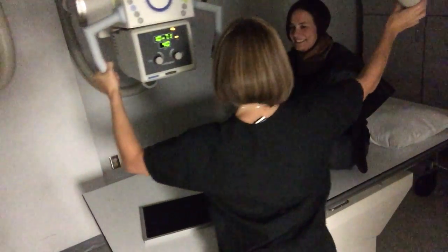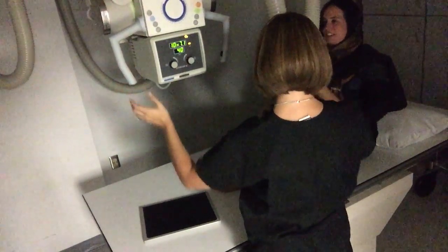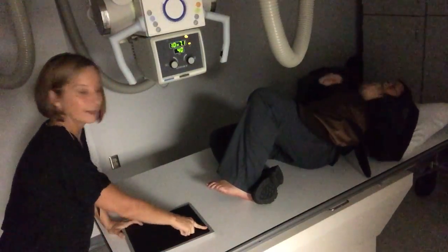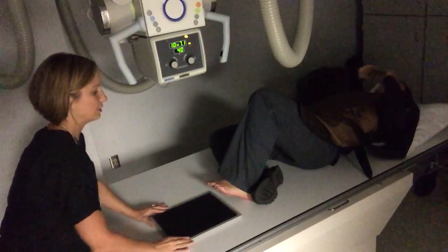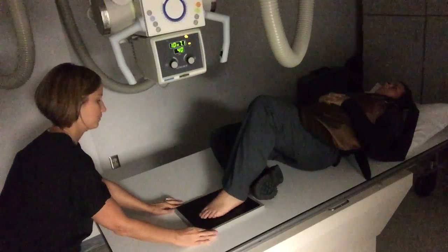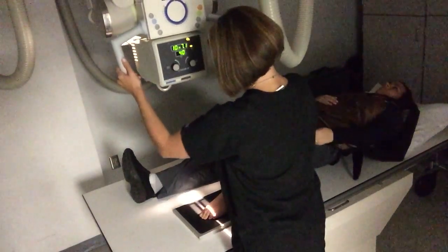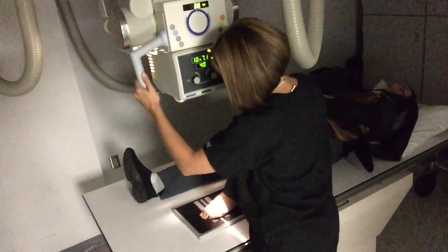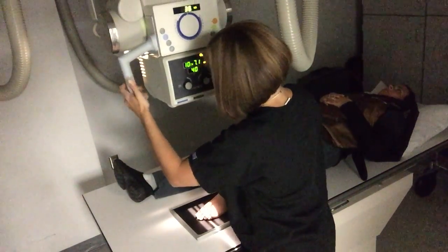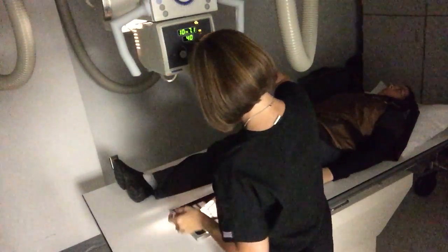I'm going to make sure that I have the red line on my cassette facing her head. I'll have her put her foot flat down on this board. We're going to do the AP toes first — there's no angle on this. You're going to center right on the metatarsophalangeal joint, which is right in the middle. Make sure your SID is set at 40 inches.